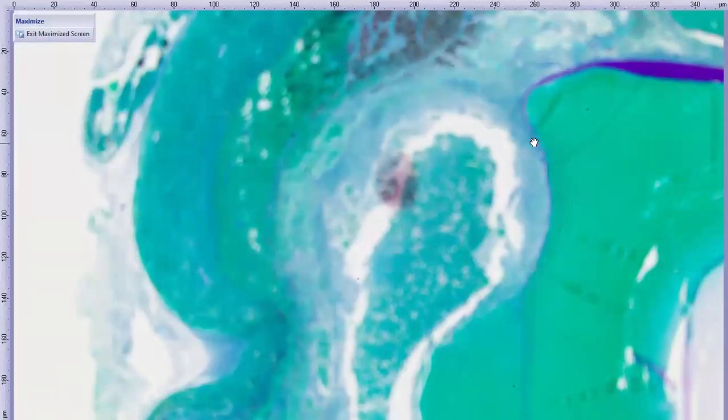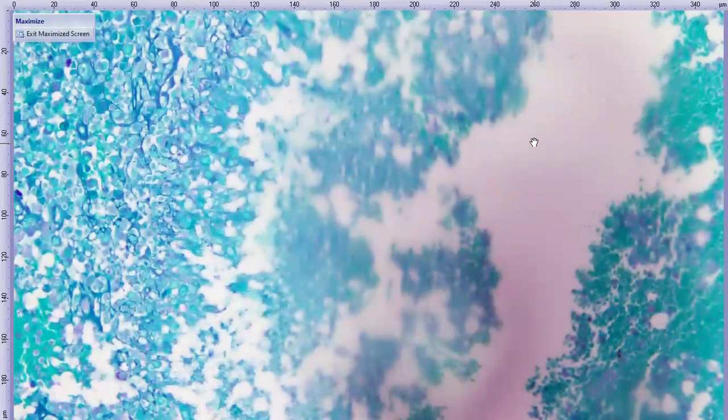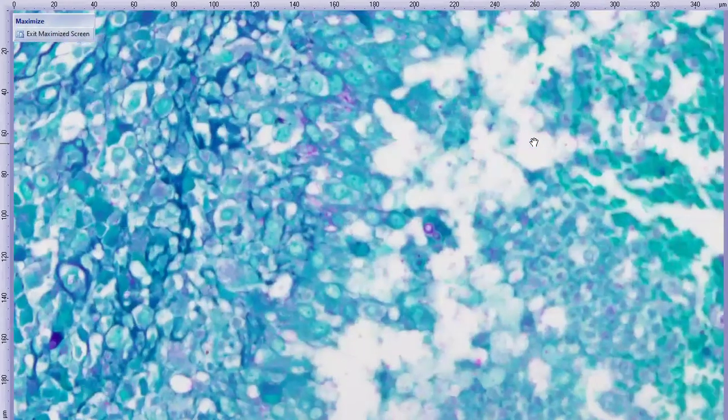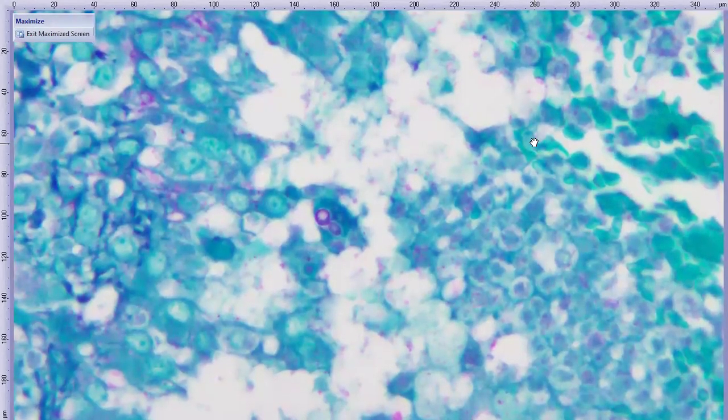The camera is freaking out. All right, here we go. Oh, because I'm on the wrong objective. All right. Oh, I did do a dot here. Thank you, past me. There we go. Whoops, that was as close as we could go. All right. So here we are.